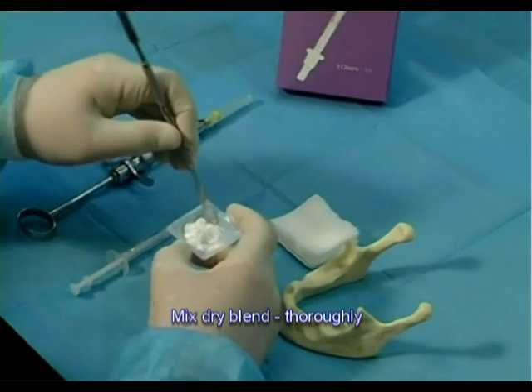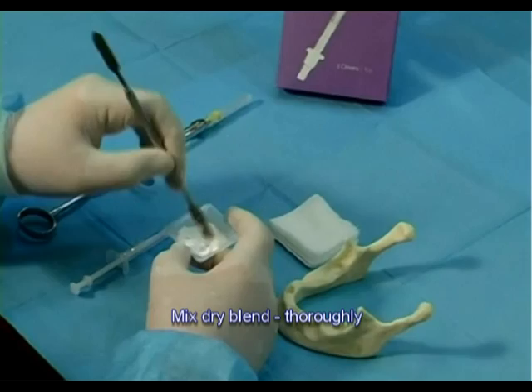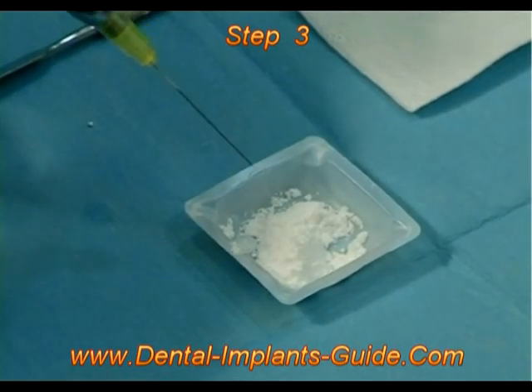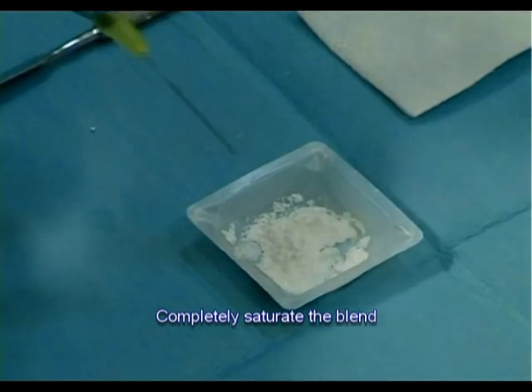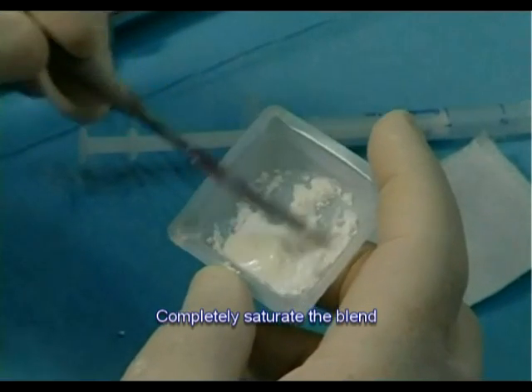Step 2: Use a spatula and mix the dry blend thoroughly. Step 3: Add saline for complete wetting of the blend. This is important in order to achieve a complete moistening of the blend. Use a spatula to mix the blend thoroughly.